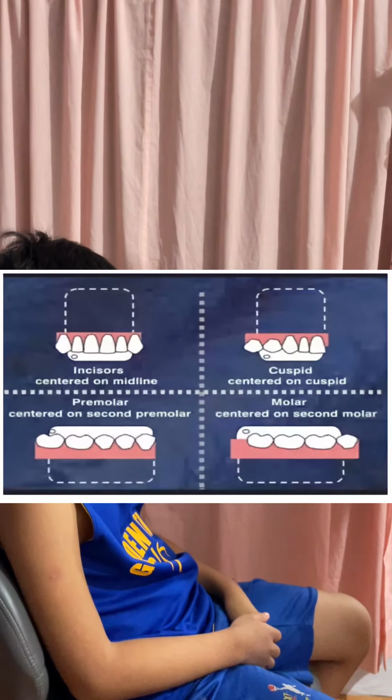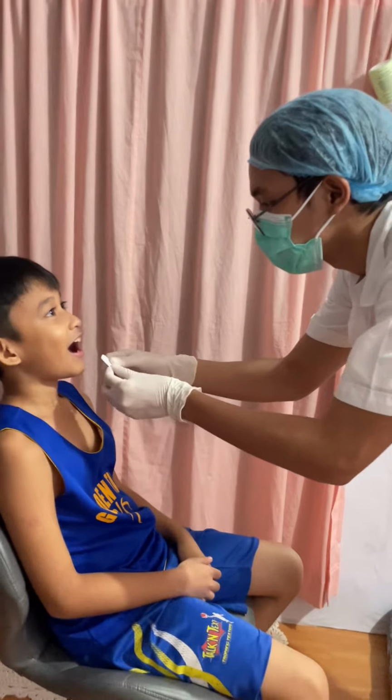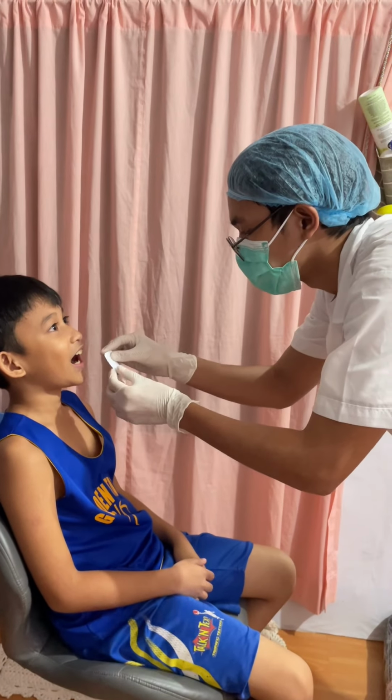The next step is to place the film properly. Locate the identification point of the film. Make sure to position the identification point in the incisal part of the tooth. The orientation of the film is vertical since we are using it in the anterior teeth.